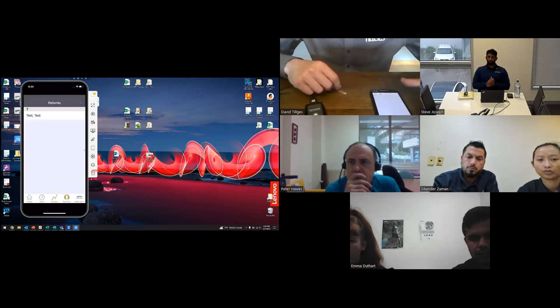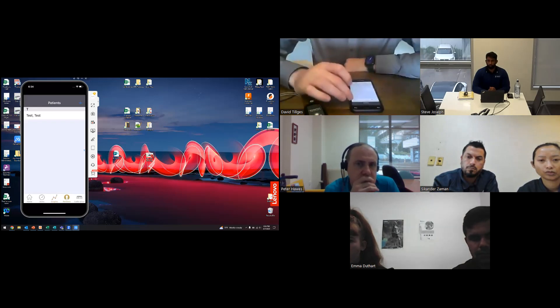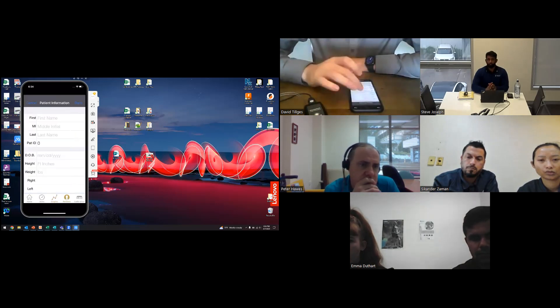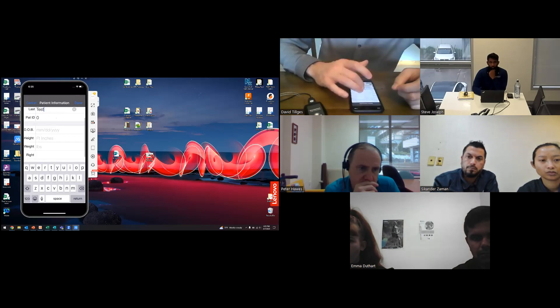The patient tab is where you enter all patient information. I'll do that quickly — to save time for questions I won't fill everything out here.